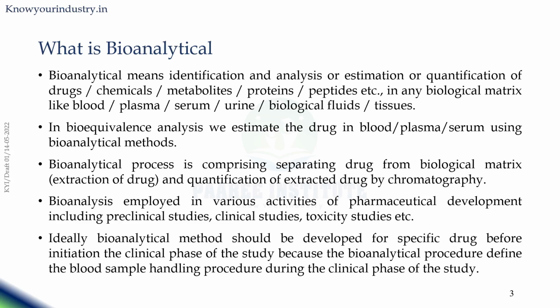There are two processes comprised in the bioanalytical process in bioequivalence studies. Bioanalysis is employed in various activities of pharmaceutical development, including preclinical studies, clinical studies, toxicity studies, etc. So apart from bioequivalence studies, these bioanalytical processes are used in preclinical studies where animal pharmacokinetics are established, and in toxicity studies, where drugs are measured from the organs for toxicity. The applications of bioanalysis are wide open, and here we are focusing only on bioequivalence studies.